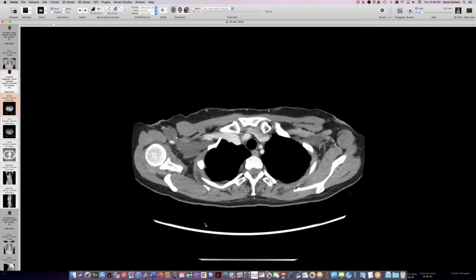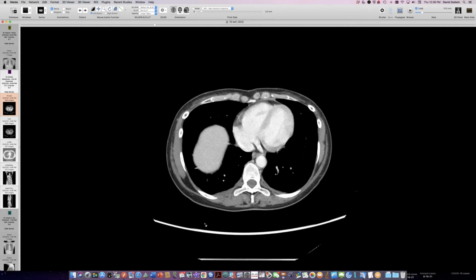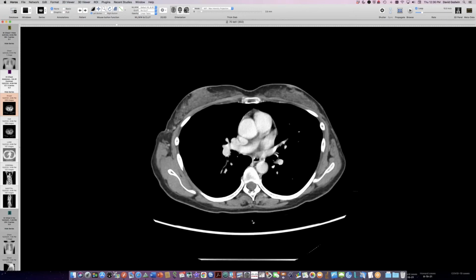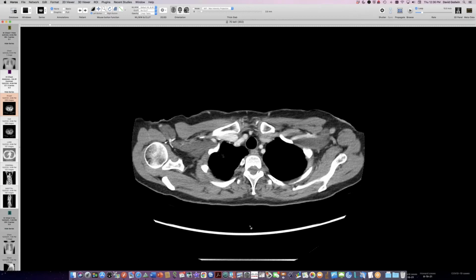They certainly can be low just from the myelin. Maybe that's lower than typical. Or if you see large plexiform neurofibromas, they can be low attenuation. But I mean, that's an impressive case. I'll pull out the case that Sudhakar showed, I'll show it next week, and I'll look at the attenuation, see if it's similar to this or whether this is distinctly lower. That would be an interesting comparison.